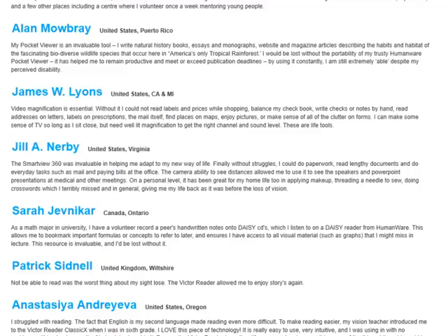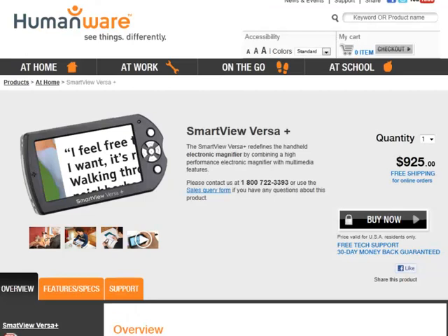There are also handheld magnifiers, such as the SmartView Versa Plus, which is easier to transport. Although the screen is much smaller, this version is more practical for students who need a magnifier on the go or are carrying it to school every day.